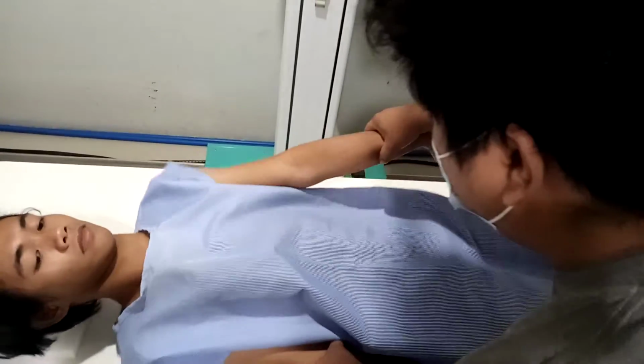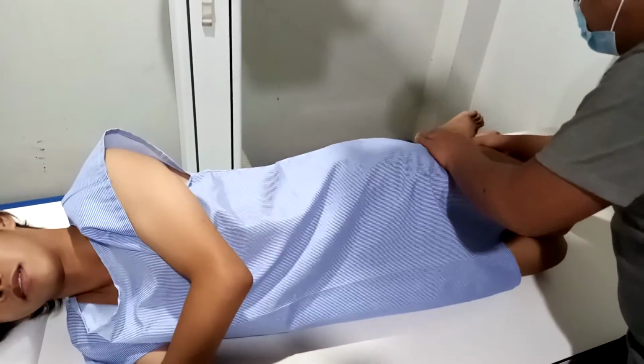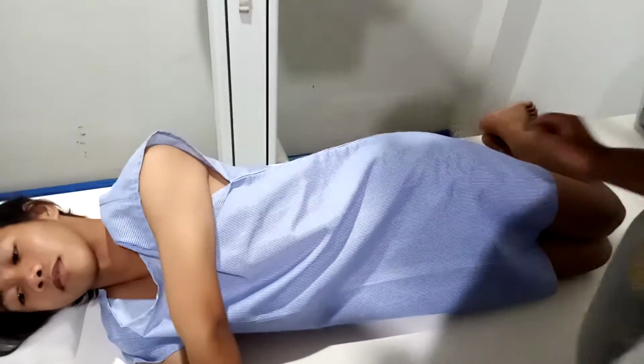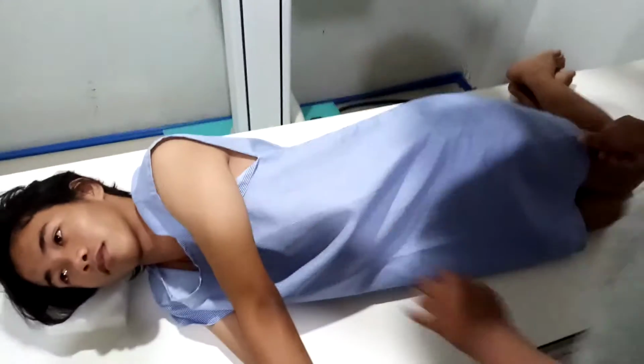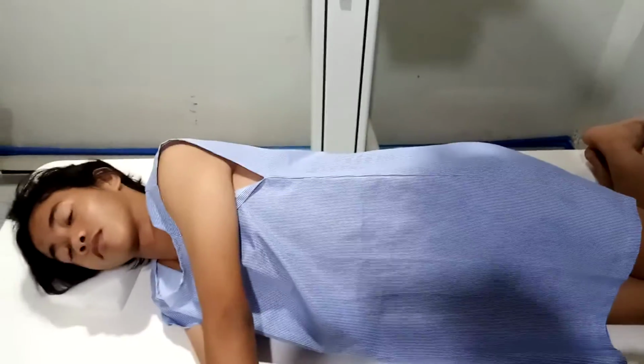Lateral, sir. Then hips flexed. Again, the hips and the knees of the patient should be flexed to straighten up the back of the patient.